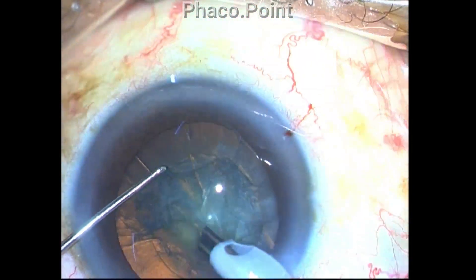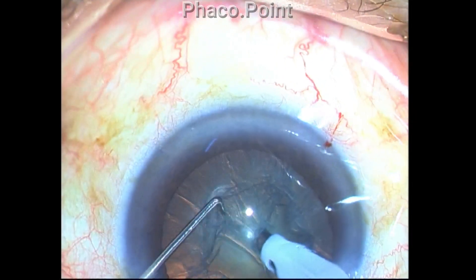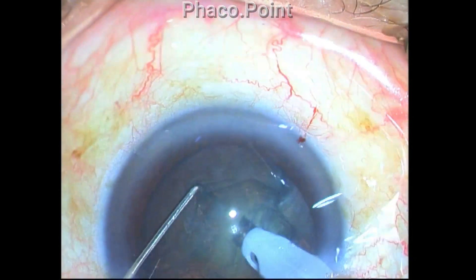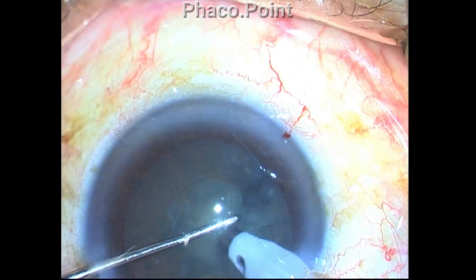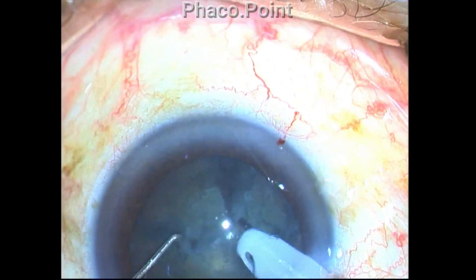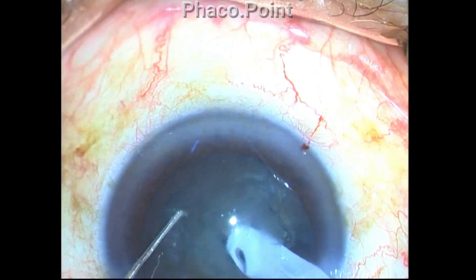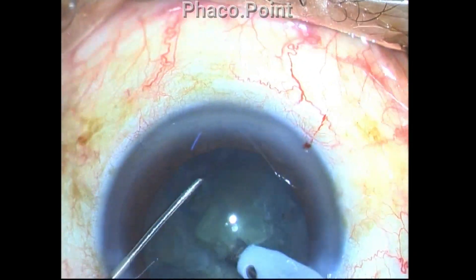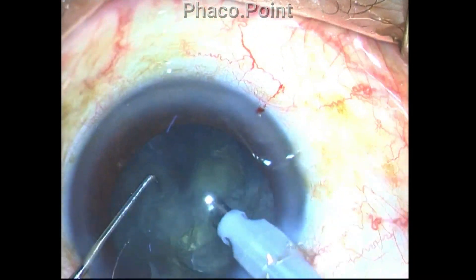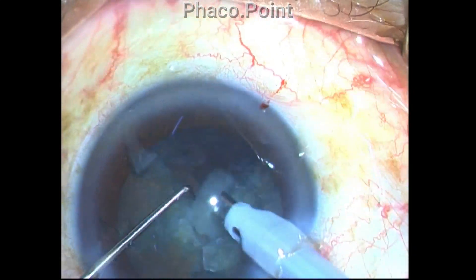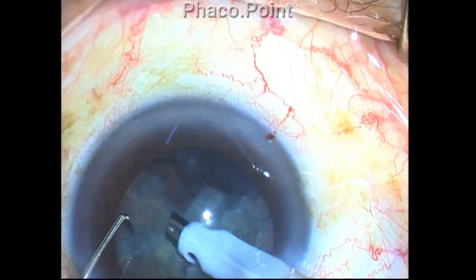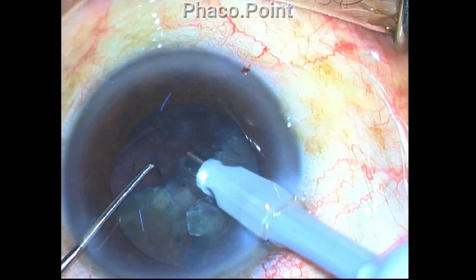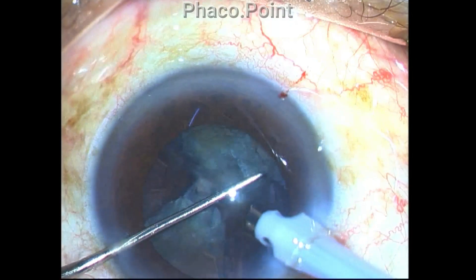The nucleus disassembly technique is now being performed, and my technique of choice is the direct phaco chop technique. I start off by downsizing or breaking down the nucleus into multiple small fragments with the help of my sharp tip chopper. Once I've got an adequate number of small size fragments, I then mobilize each of these small fragments, bring it to the central safe zone, and adequately emulsify the entire nucleus fragment before I move to the next fragment.